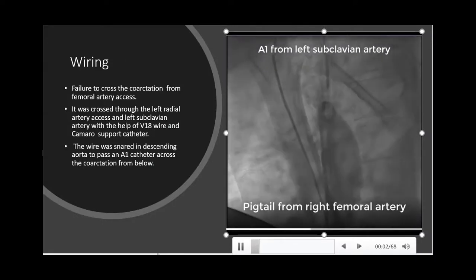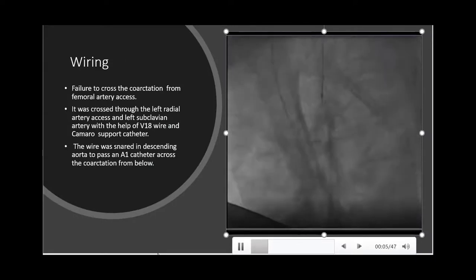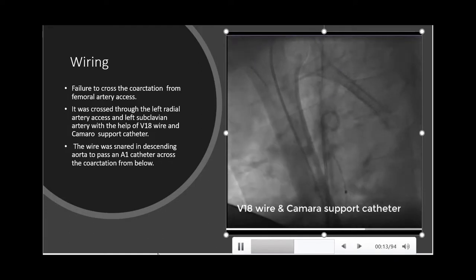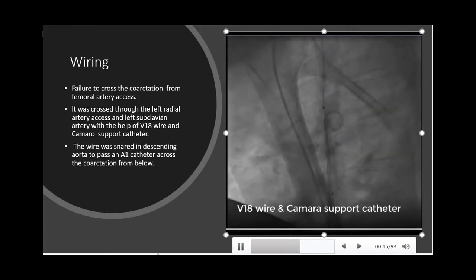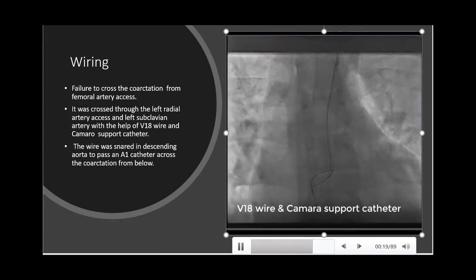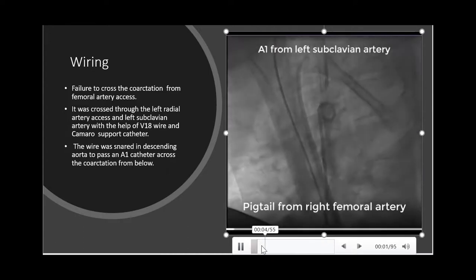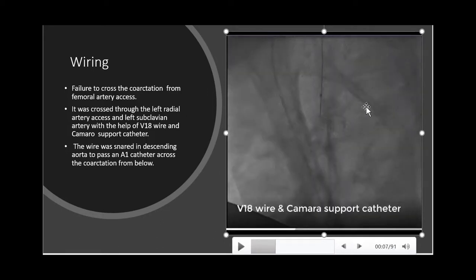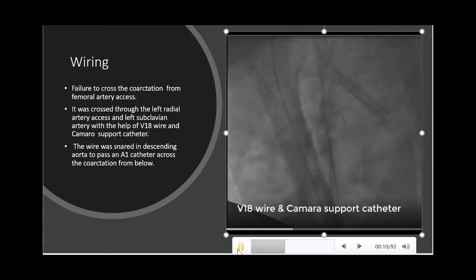We failed to cross the coarctation from the femoral artery axis. The coarctation was then crossed through the left radial artery axis and left subclavian artery with the help of a V18 wire and coronary support catheter. The wire was snared in the descending aorta to pass a catheter across the coarctation from below. In the video, you can see the catheter from the left subclavian artery, with the V18 wire and support catheter from the left radial artery axis, which successfully crossed the coarctation.